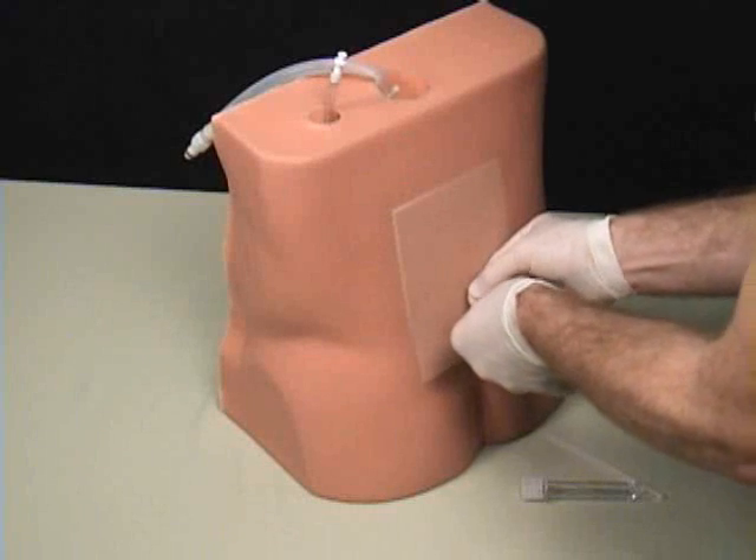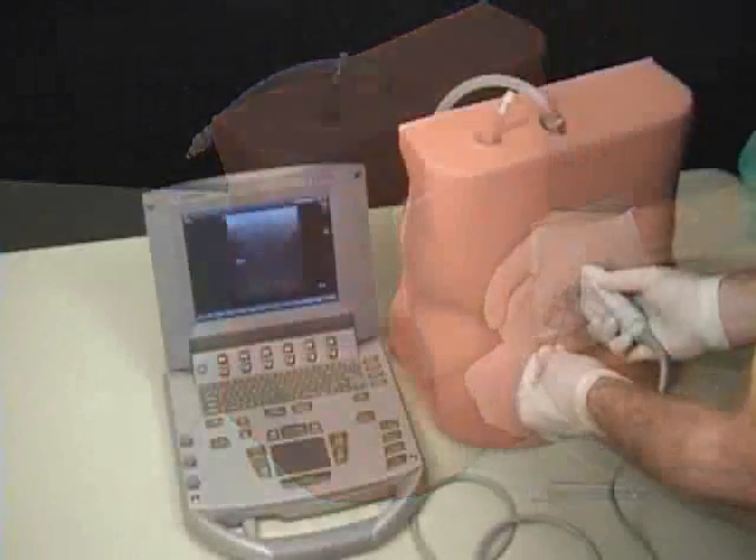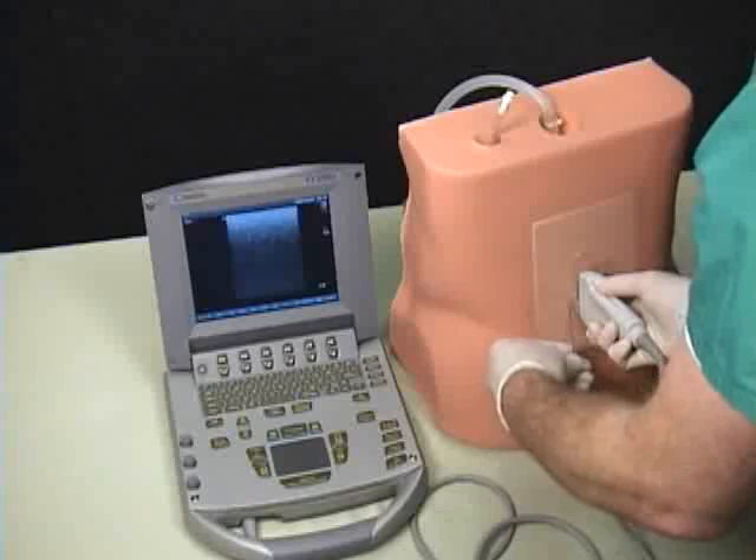This trainer's replaceable tissues are highly durable for multiple uses, and they are self-sealing, so repeated procedures will not leave needle marks when viewed under ultrasound.